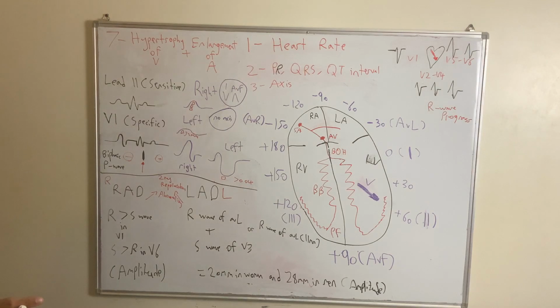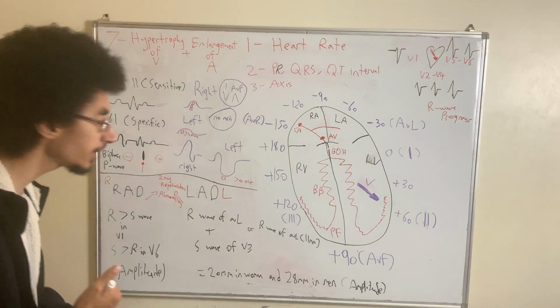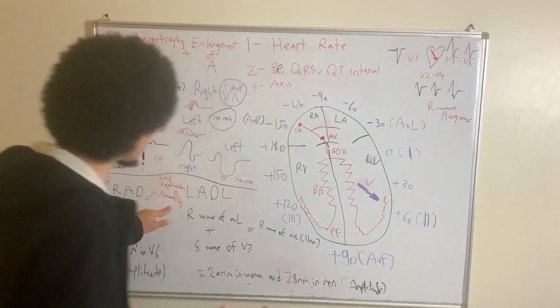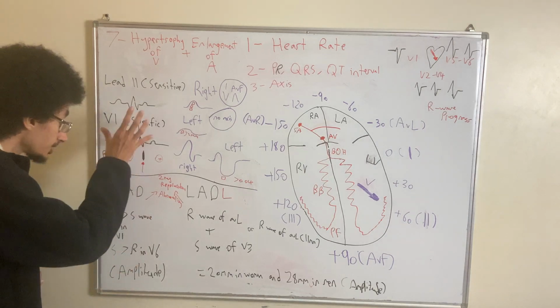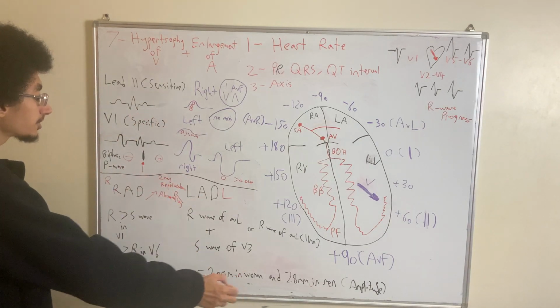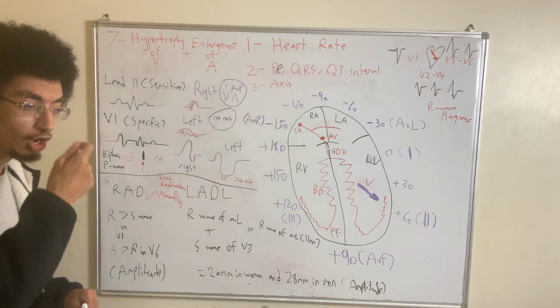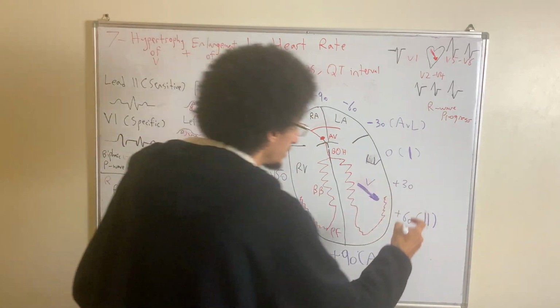Very simply, basically, let's assume we have right ventricular hypertrophy, alright? So when we say there's secondary repolarization abnormality, that means in addition to all of these findings, you will have this abnormality in repolarization. That means in this drawing, it will look like this.